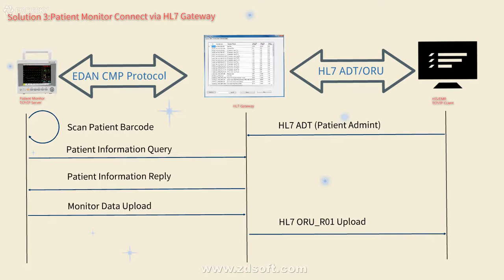Once the information is located, it will download the information to the patient monitor, and then you can begin your examination. Once the examination is complete, it will re-upload the information to the HL7 gateway and then transfer the information via HL7 to the HIS EMR software.